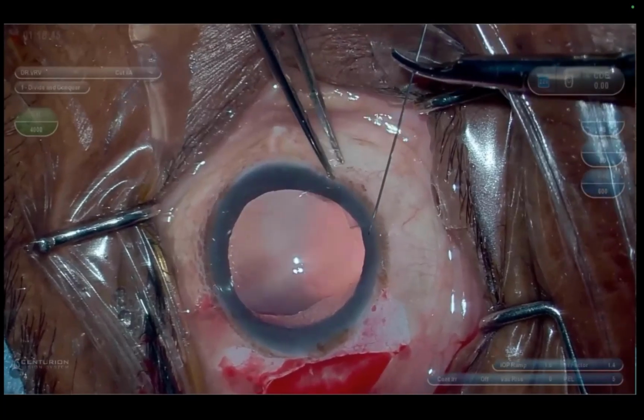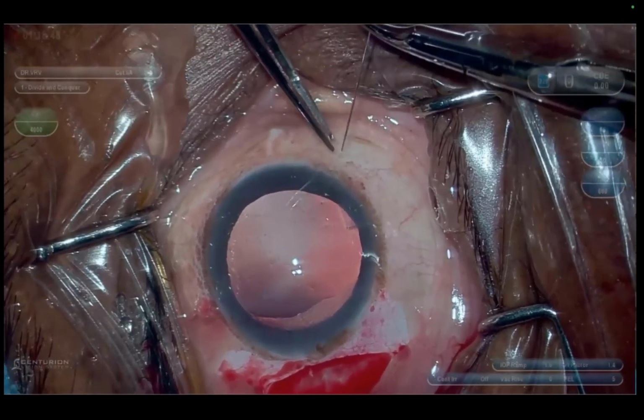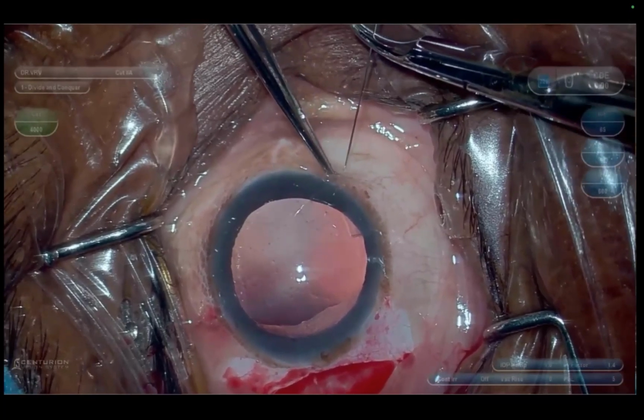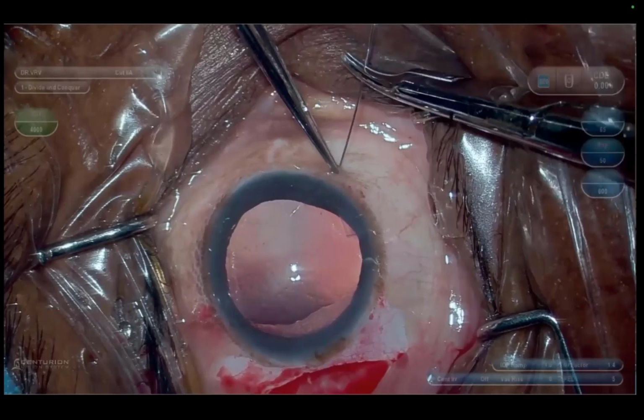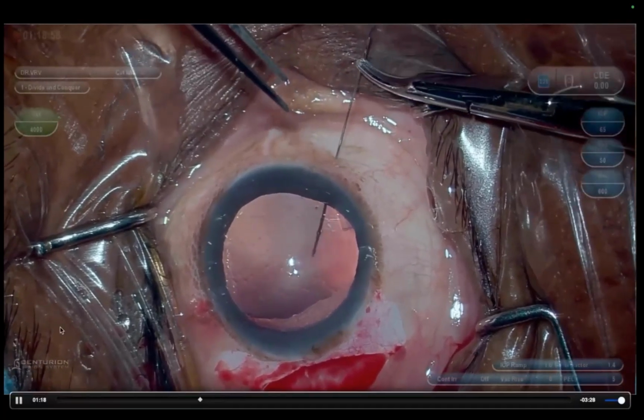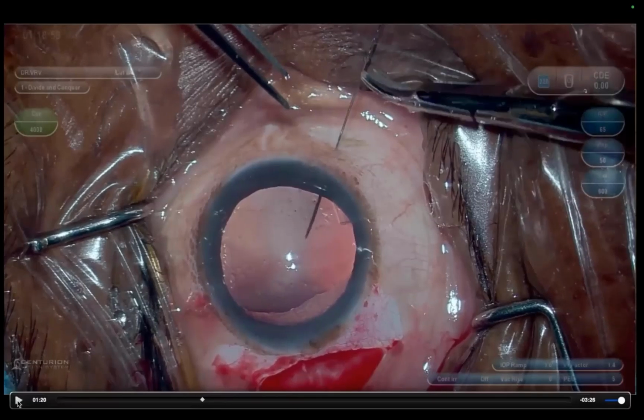we do a sclerotomy. This is the needle that we have designed. So you position the needle where you have to make the sclerotomy, catch the conjunctiva tenons, move them radially, and then do the sclerotomy. So this step is very, very important because at the end of surgery, you want intact conjunctiva and tenons covering the flange.